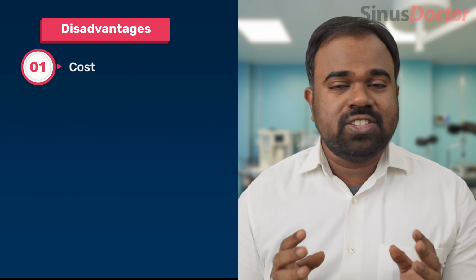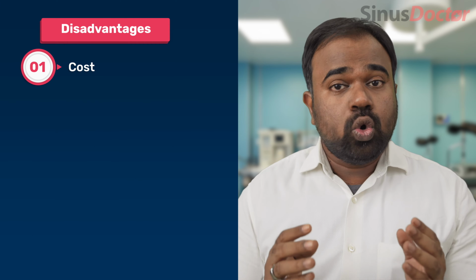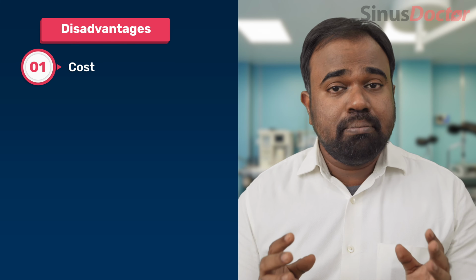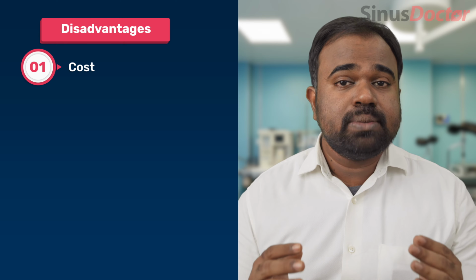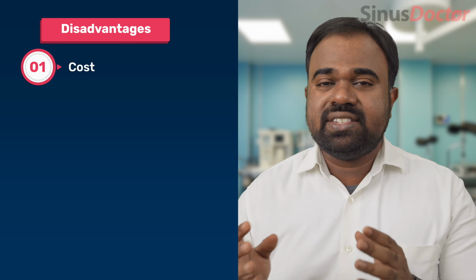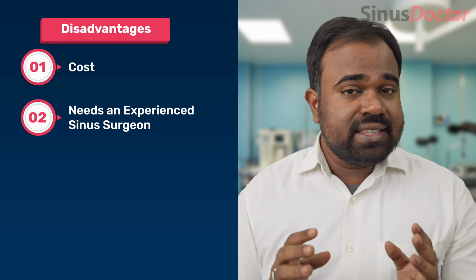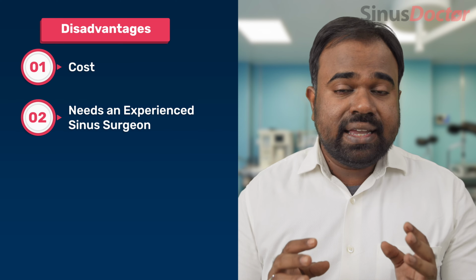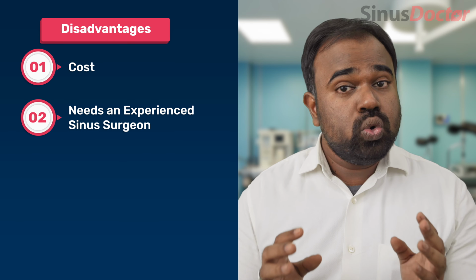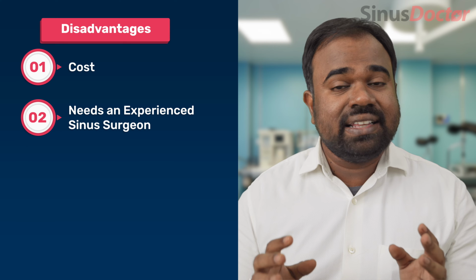The first disadvantage is the cost. The balloon we use for opening up the sinus drainage openings is a disposable balloon. That is, we cannot use this balloon in more than one case. So this adds up to the cost of the surgery. The second disadvantage is that balloon sinuplasty can only be performed by an experienced sinus surgeon who knows the anatomy of the nose and sinuses like the back of his hand.